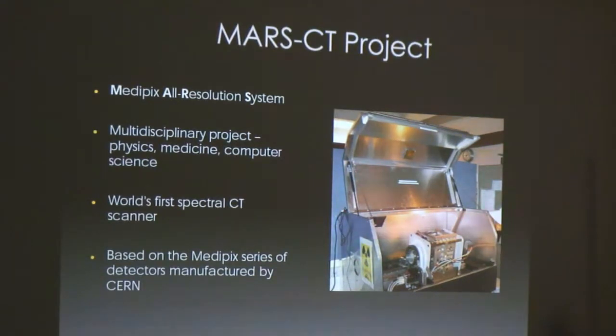So currently, this is what is called micro CT, and it's used for preclinical imaging, which basically means we have to image small animals like mice or pieces of human tissue. And we do that because we have to prove that this technology is safe and useful. This brings together physicists, doctors, biochemists, and even some computer scientists like me.